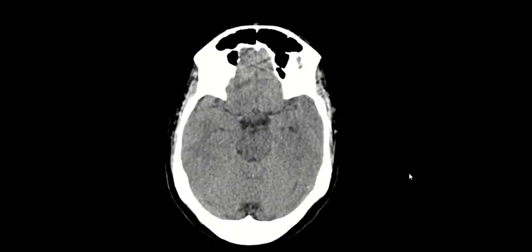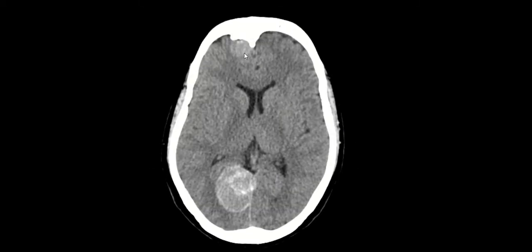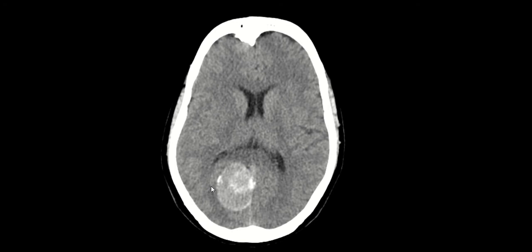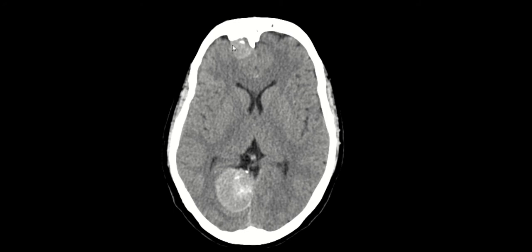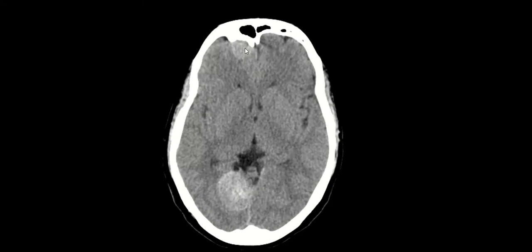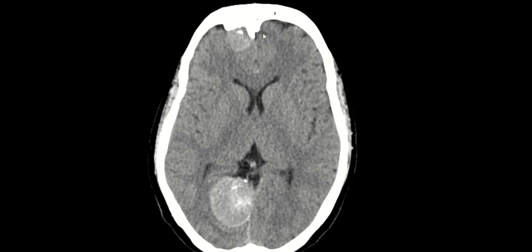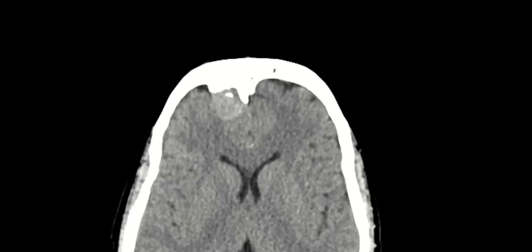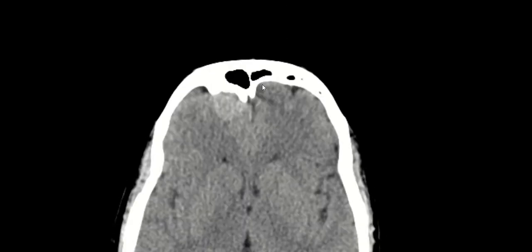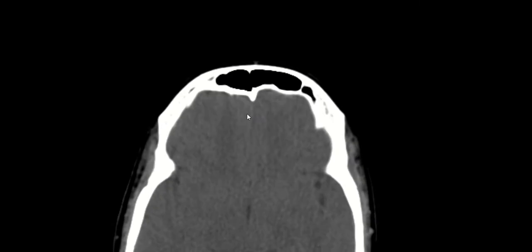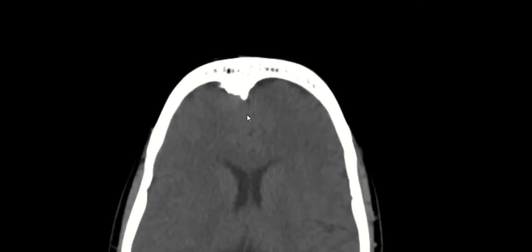A patient presented with a headache. We have two large lesions: one based in the falx cerebri projected towards the right occipital region, and another near the right frontal region. Both are hyperdense with specs of calcification. Also notable — and this is something I initially missed — there is hyperostosis visible here at the right frontal region.